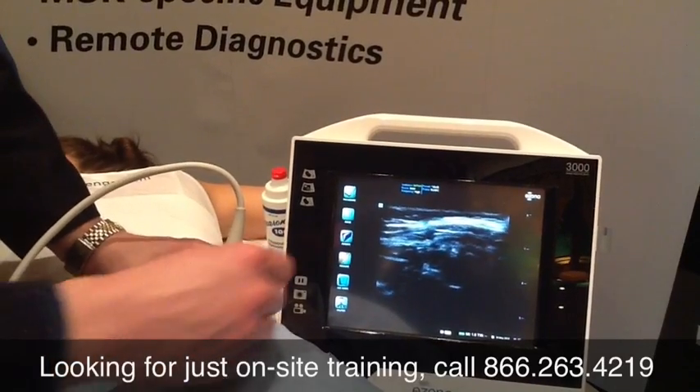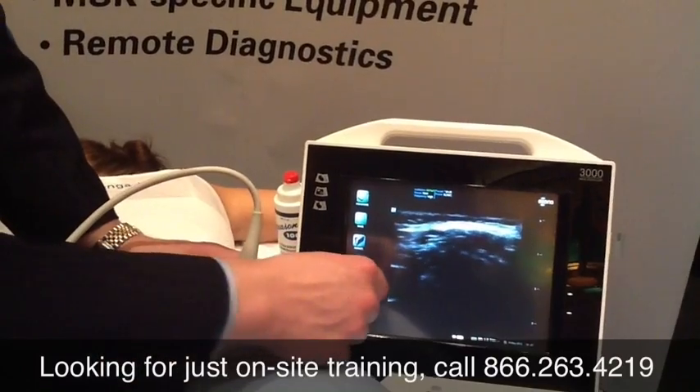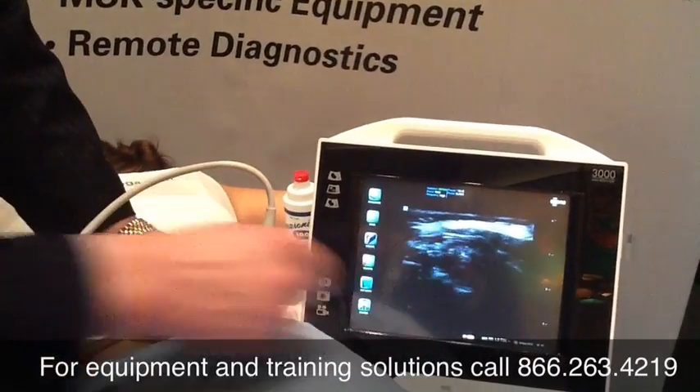What I can do is identify this as point A and this as point B. My SI joint is going to be just below that.